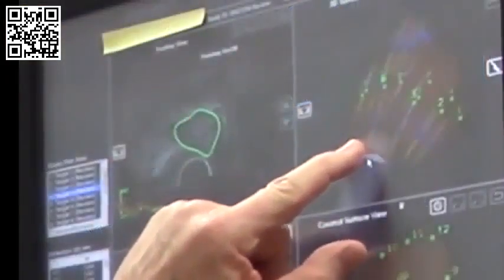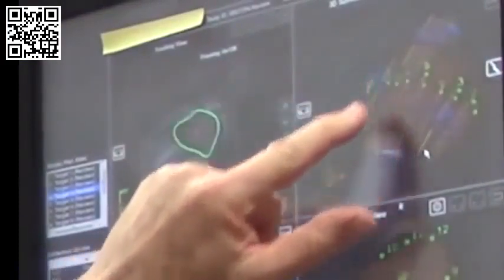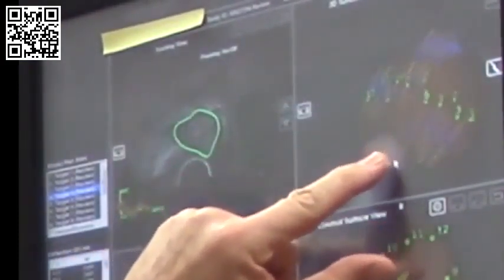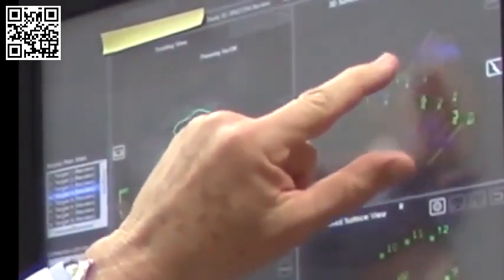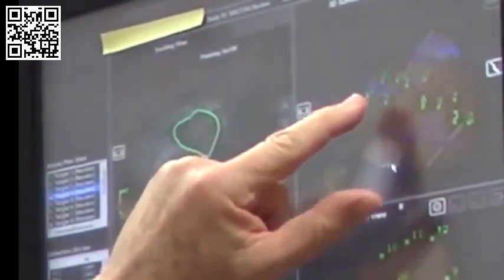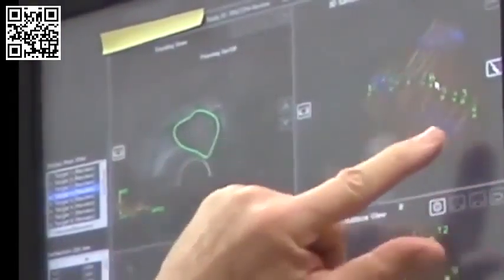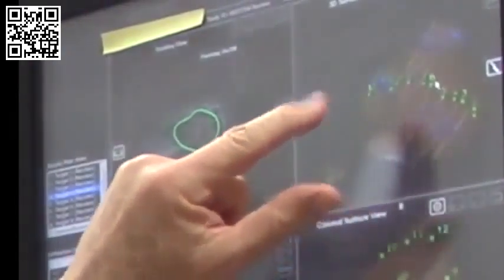Here's an individual with a prostate shown in brown, ultrasound probe here, body position here, and this individual had a target picked up on his MRI which was not detected by ultrasound and which is outside of the normal catchment for a conventional prostate biopsy. However, when we were able to identify it on the fused image, we could then target it and determine what it's made of, in this instance, a high-grade prostate cancer.